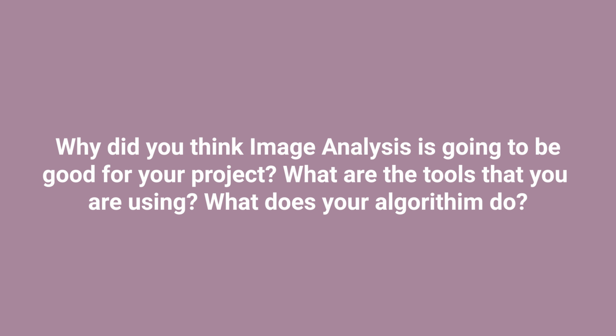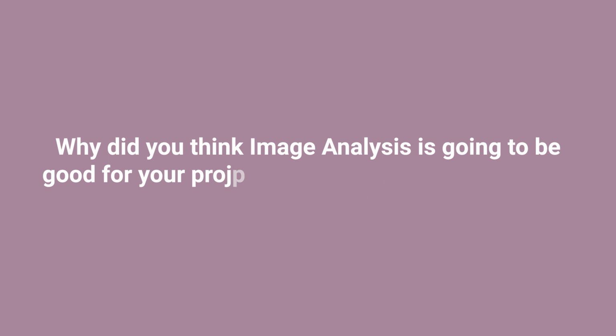So tell me about the project. Why did you think image analysis is going to be good for your project, and what were the tools that you were using, and also what does your algorithm do? I'm interested in that as well.